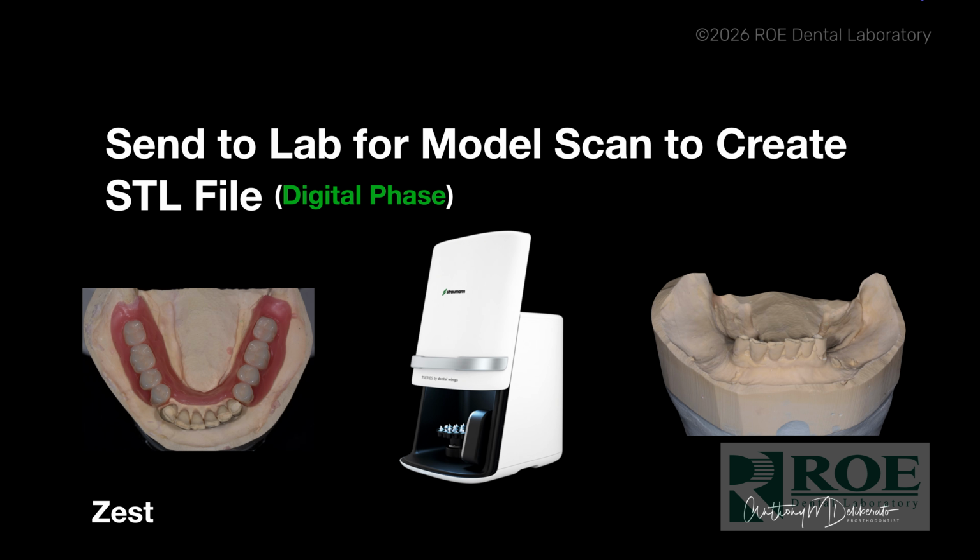It's very important that during all the procedures we've done, setting up the teeth, we leave those lower teeth untouched, no chipping of the teeth, because if the surgical guide doesn't fit properly, then we've wasted our time and we're not going to be able to use the guide at the time of surgery.